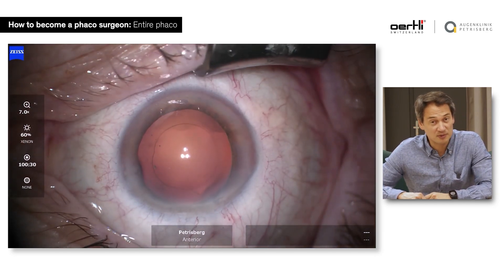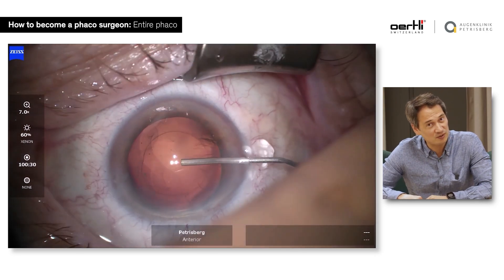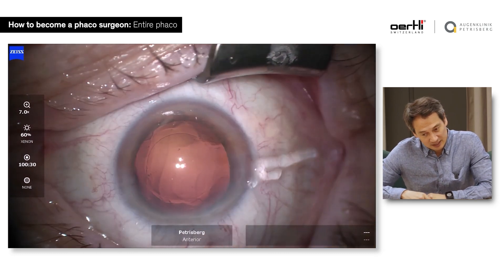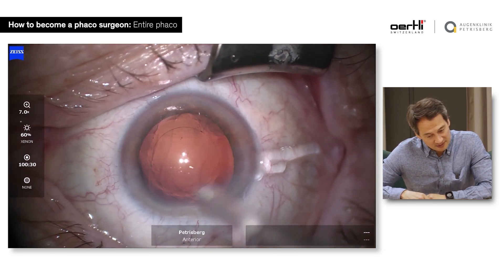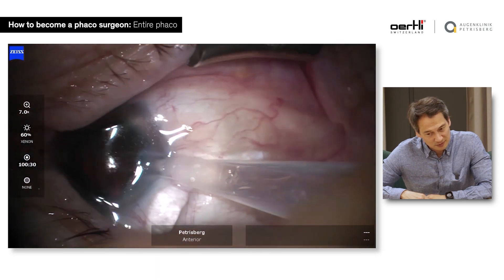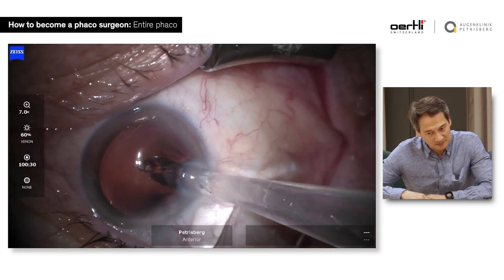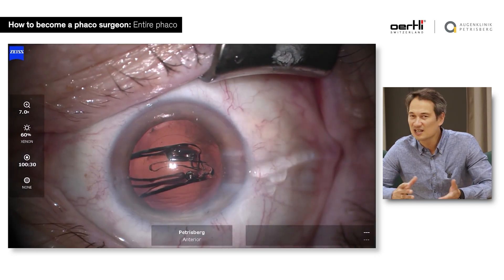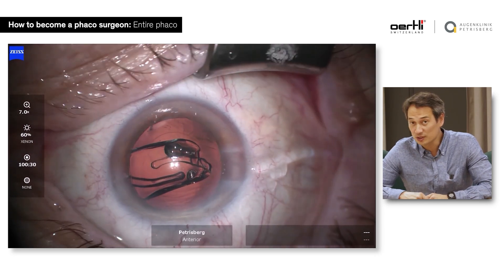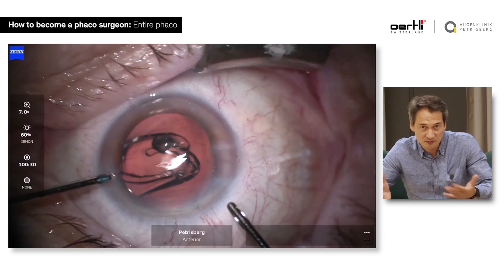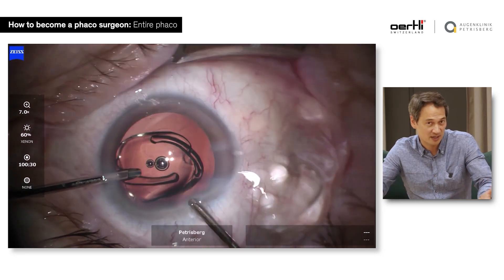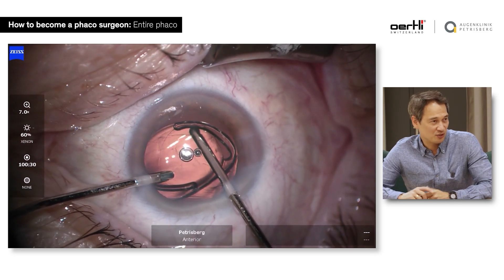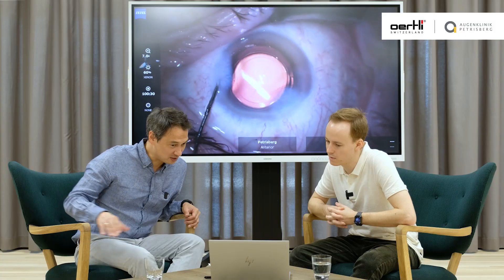With the irrigation/aspiration, I'm very careful and try not to manipulate too much in a bimanual fashion because I don't want to rip the capsular bag at this point. Most complications happen in the last third of the cataract operation, so you need to be extra careful there. It's very important to be extra careful even when injecting OVD before putting in the lens. Many surgeons don't do it, but I do it for capsule back support and protection.